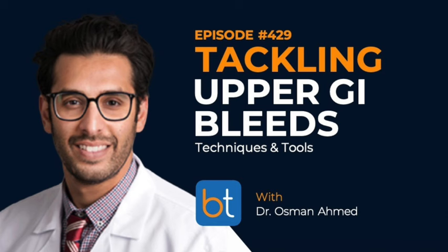Okay, perfect. And what was your first case? Was it a GI bleed or a trauma? Yeah, I think my first case was actually a pre-op tumor embolization. Oh, okay, like those RCCs that you're often referred to devascularize prior to an orthopedic surgery. Yes, and I had a run of them when I wanted to start using Obsidio, which was really nice. I also had a trauma, a liver laceration case, that I used it for. So not exactly upper GI bleeding per se.